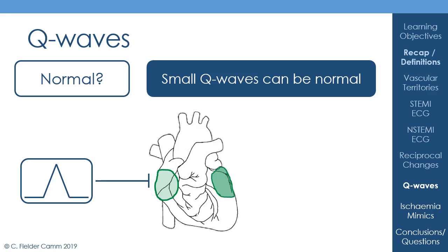And you've got another area of myocardium over here, and you've got another lead. And again, it'll show a positive deflection. But if you were to infarct this lateral area of muscle here, that lead that's looking at it isn't going to see any signal from that area of cardiac muscle. That's going to become completely inert, and people describe it as being an electrical window. Okay, so the lead doesn't really recognize there's anything there at all, and so instead is looking at the next part of muscle that it can see, which is this part of the heart, the other side.